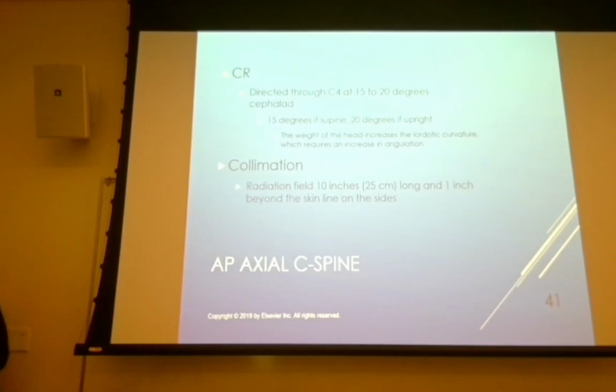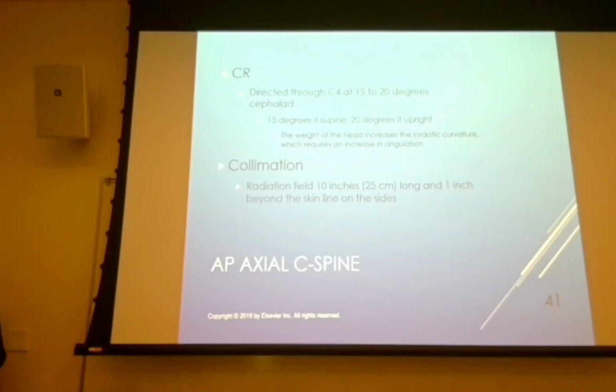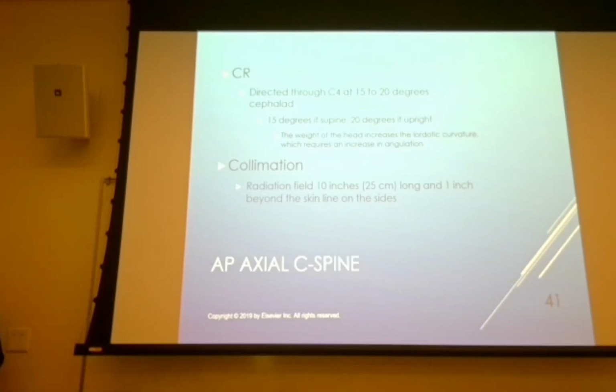So the difference between the 15 and 20 degrees, you're probably not going to see on even all the way through the registry, this specific question. You'll probably see one in your critique class in your second year, but all the way through the registry is probably just going to say 15 or 20, or 15, 20 degree, give you the entire range, because that's what's in Merrill's. Some of your other textbooks will dial it in a little bit tighter and they'll say that you need the 15 degree angulation if the patient is laying down.